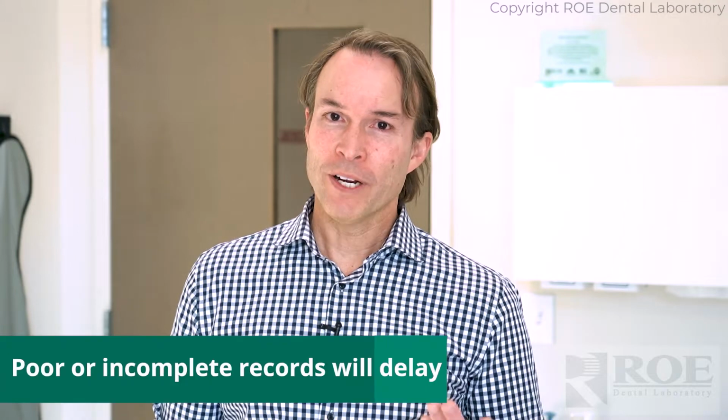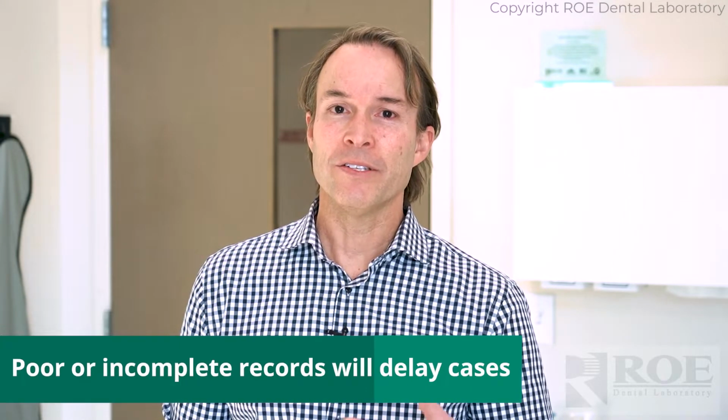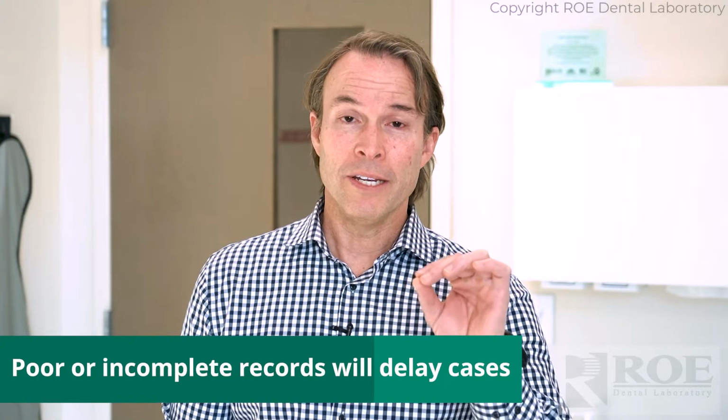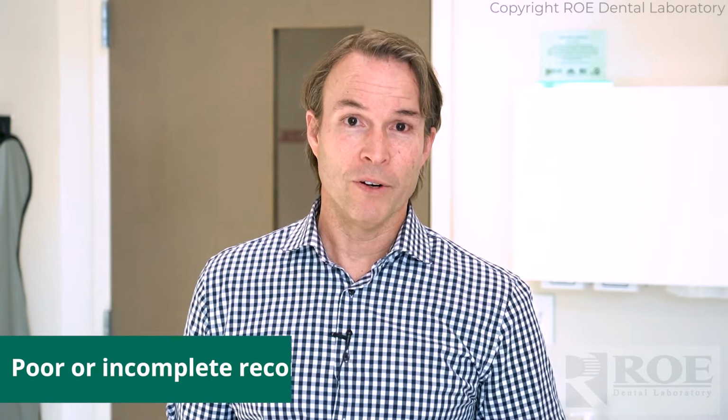So why are these photographs so important? Because when the records come in that are incomplete or incorrect, they delay cases. And cases that are delayed make you unhappy and your patient unhappy. So we like to make sure that the photographs, the STL files, the DICOM are perfect, and this video is going to help you take the right photographs.